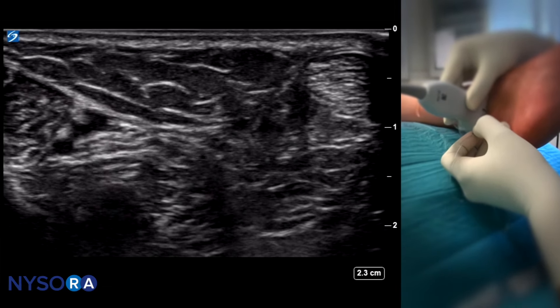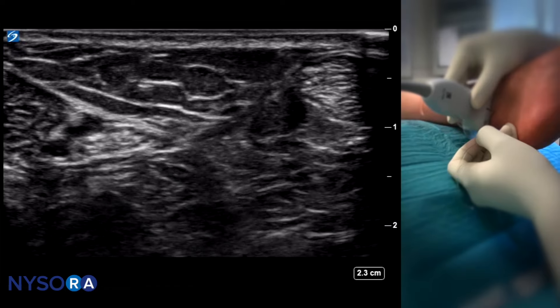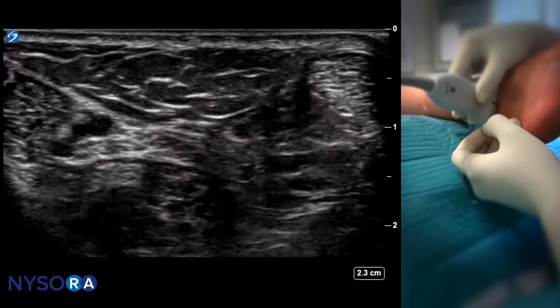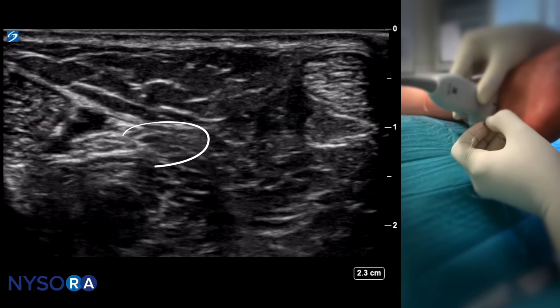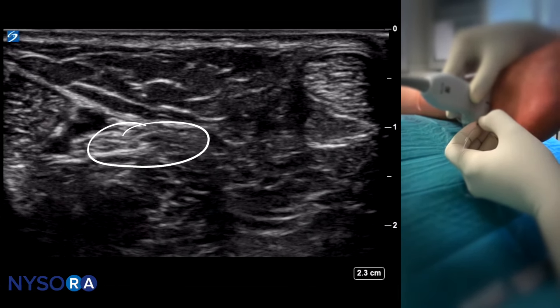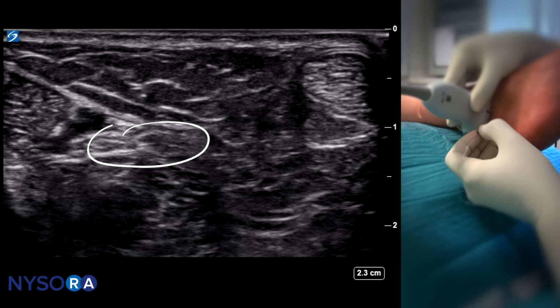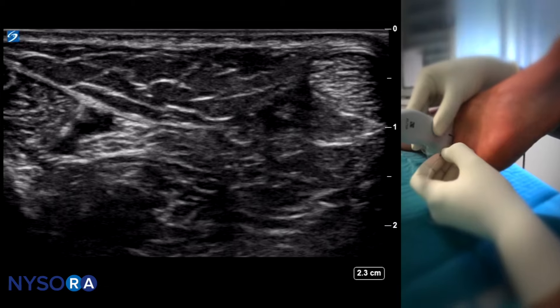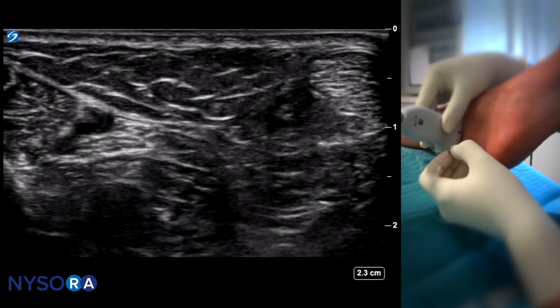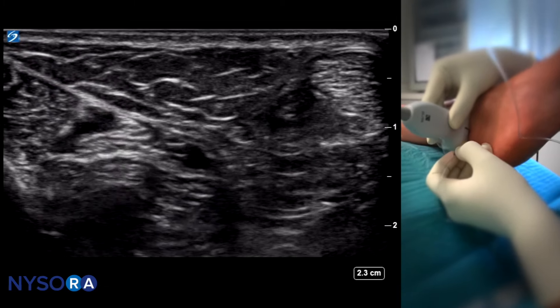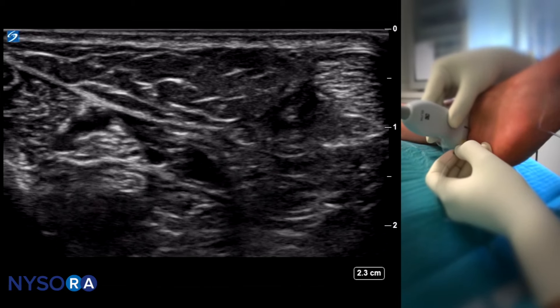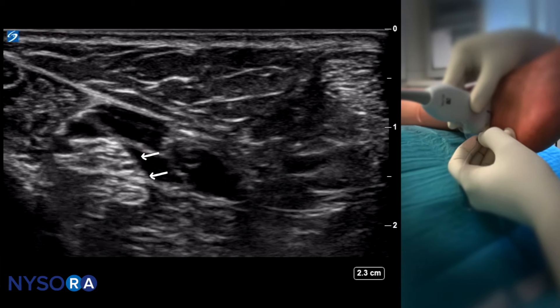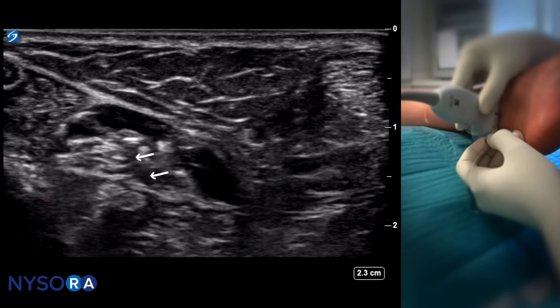The needle should now be in the position where we want it — we have passed the medial retinaculum and just entered the space where the nerve is contained. Test aspiration is negative. We don't have a nerve stimulator, and the opening injection pressure is low. Here we can see the local anesthetic displacing the nerve — every time you see the nerve displaced by the local anesthetic, you know you are in that space.